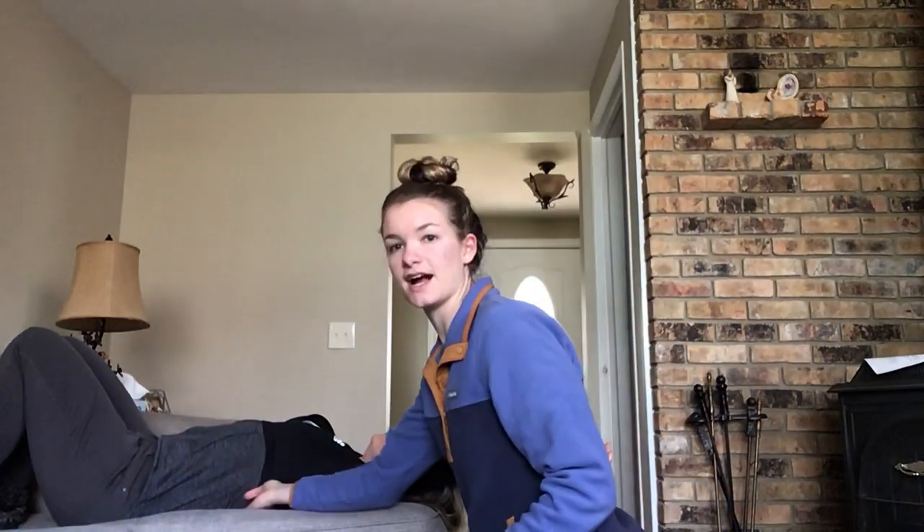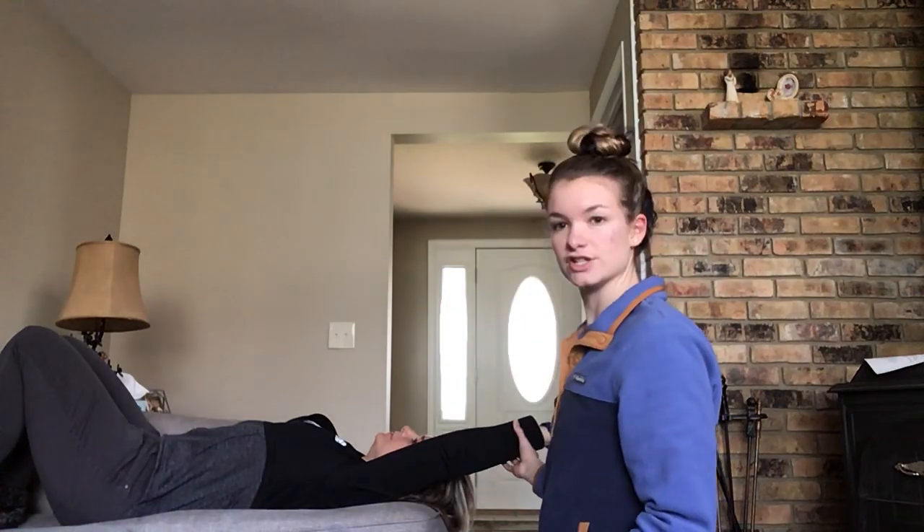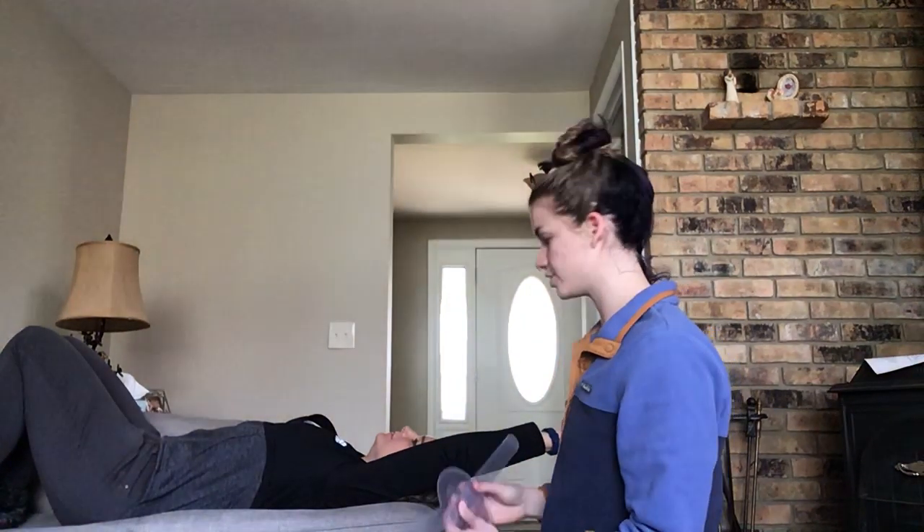I'm starting with shoulder flexion goniometer measurement. I'm going to have my mom put her arm into shoulder flexion. I'm going to make sure that she's not compensating by arching her back and she's not hurting herself by how far she's putting her arm.